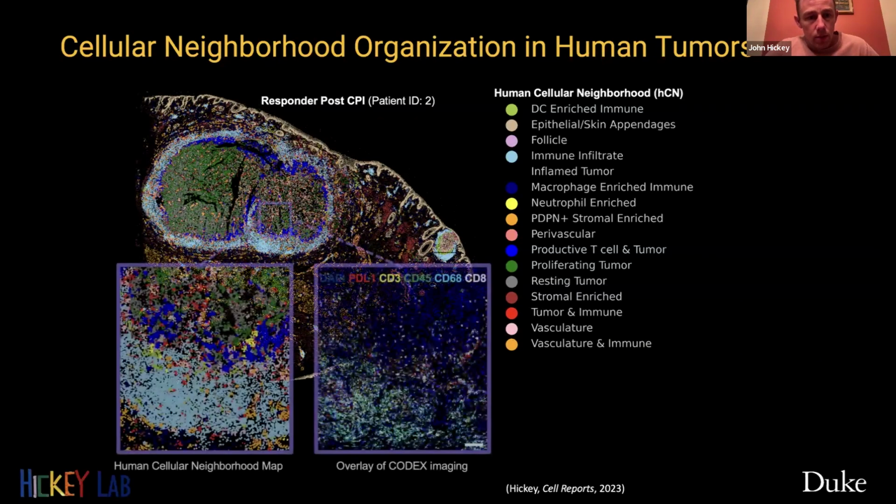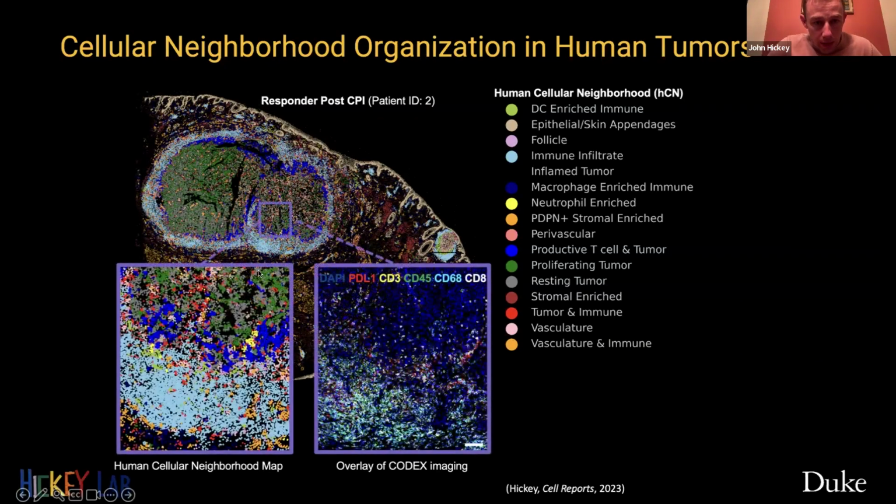And if you look at this tumor, there's a lot of complex data here, but specifically, hopefully you can see this light blue area next to this dark blue area. And this light blue area was a team of lots and lots of different types of immune cells. And it was when this team was right next to this blue team, where our T cells were actually going in and killing the tumor, when those two were next to each other and present in large amounts, we saw better outcomes for the patients.